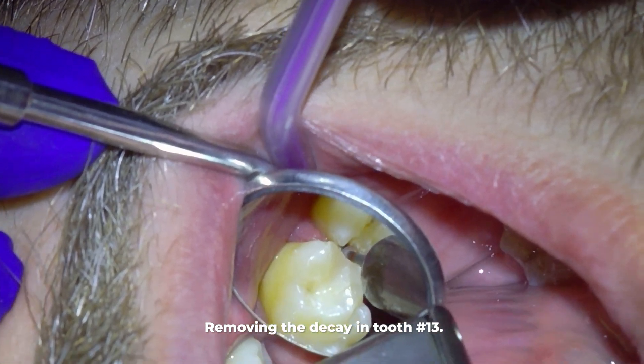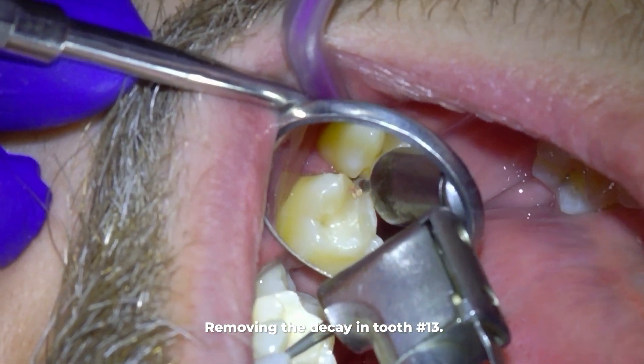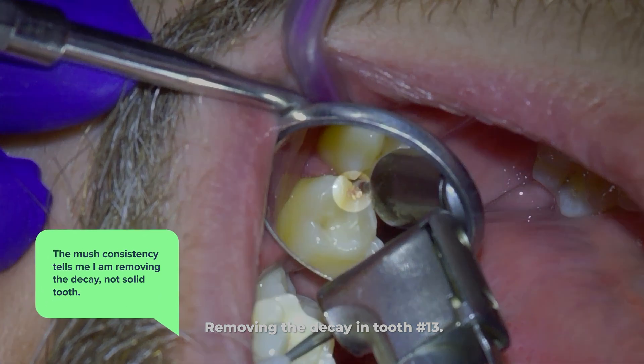As I remove the decay with the slow speed drill, you can see that the mush of decay comes out. That mushy consistency tells me I am removing decay and not solid tooth.